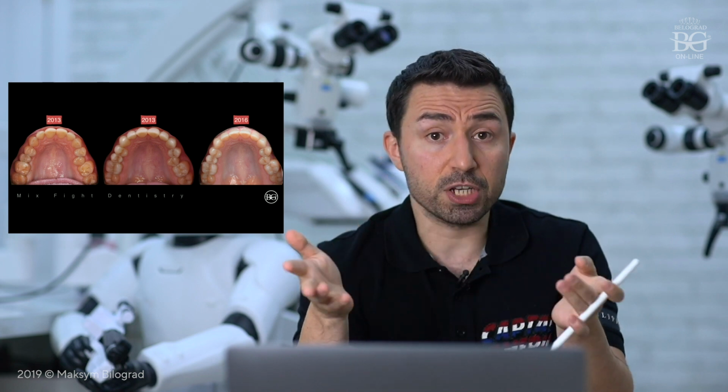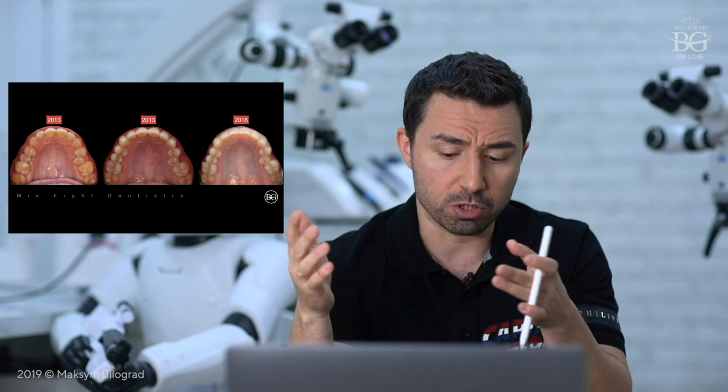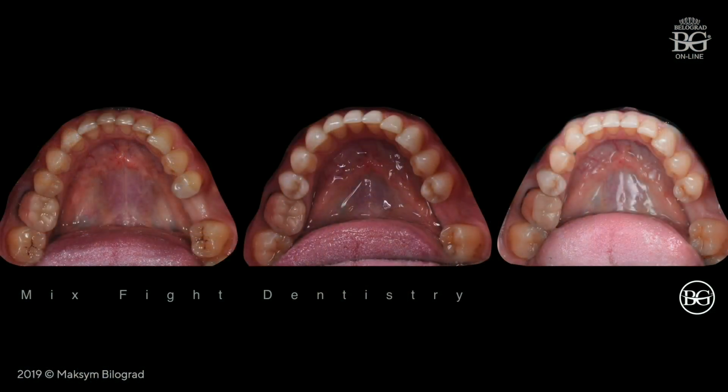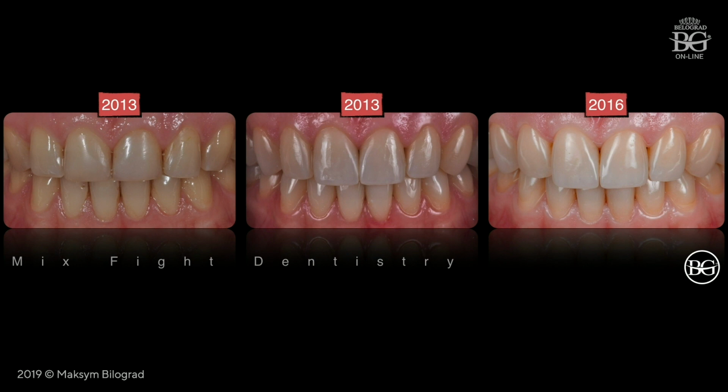After 3 years, everything is pretty acceptable, aesthetically acceptable from the patient's point of view, but also from the dental point of view, it's not bad, it's okay. Occlusion is stable. The only problem that we have here is that still we don't have a lower molar. She promised us that she will put an implant, and also when we were planning the case, we evaluated that this one has to be extracted and replaced by an implant. But still, you can see after 3 years, the tooth is in the patient's mouth, and the patient used this tooth, and etc., etc. So it works. Anyways, I cannot force my patient to extract.